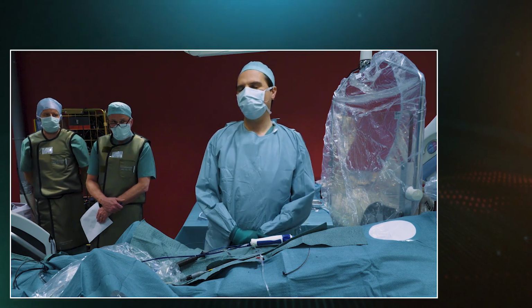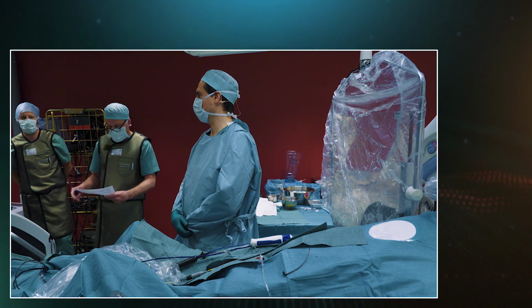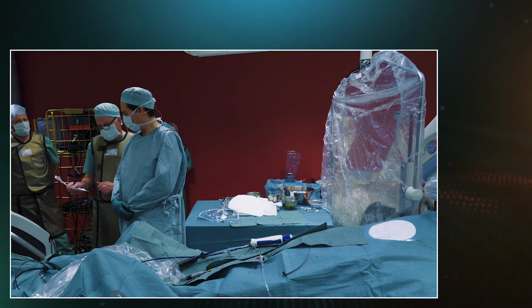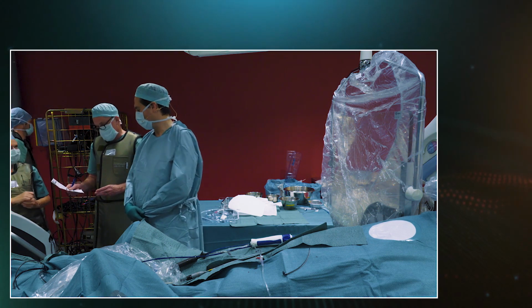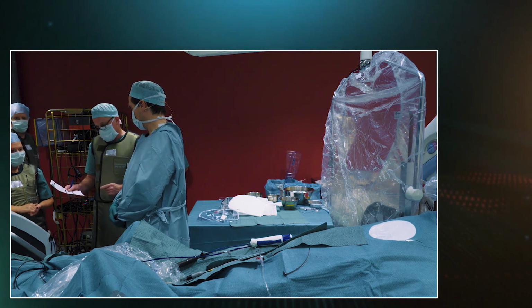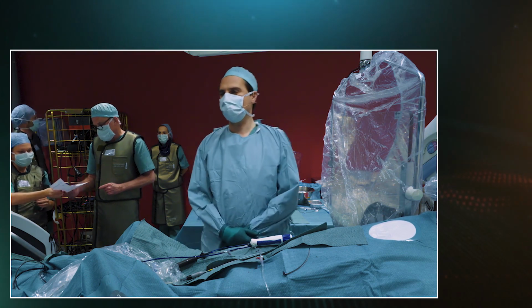So all veins isolated, 16:12, less than 50 minutes, single-handed. So we did 209 seconds on the left common, 157 seconds on the RSPV, 167 seconds on the RIPV. I think typical times for individual veins are around 180 seconds. We did slightly less for those two, and then the left common was a bit larger, of course, 210 seconds.